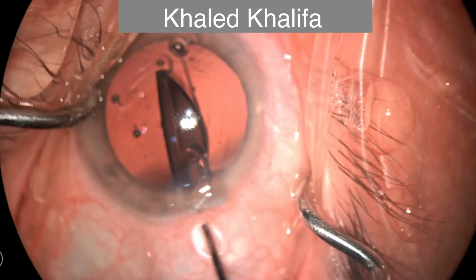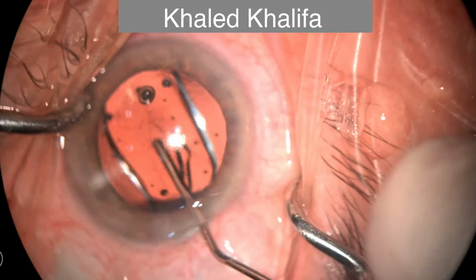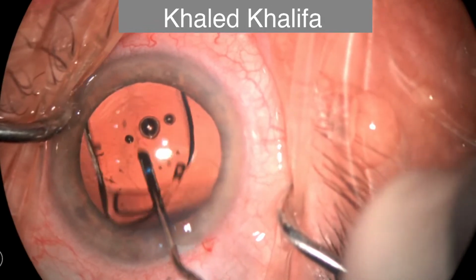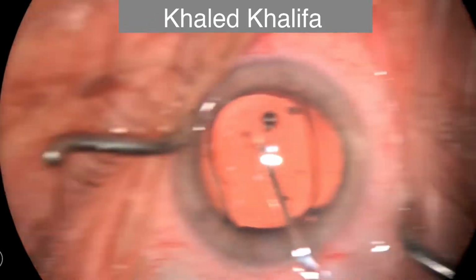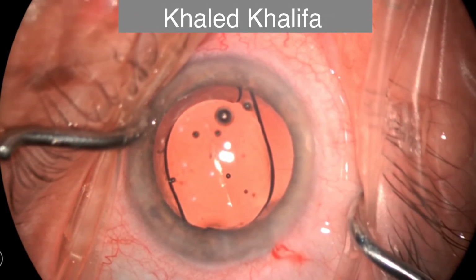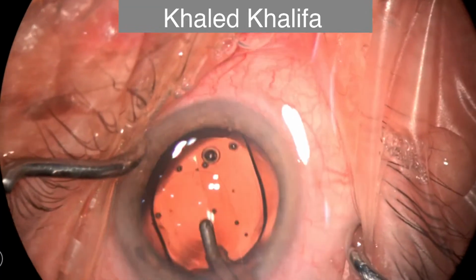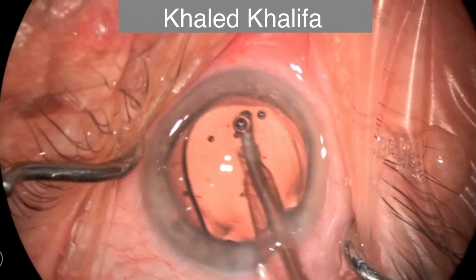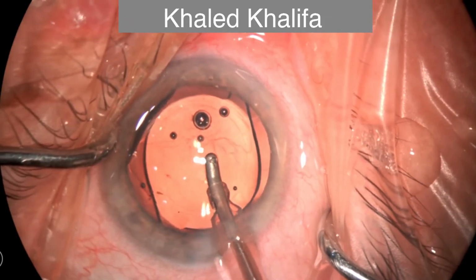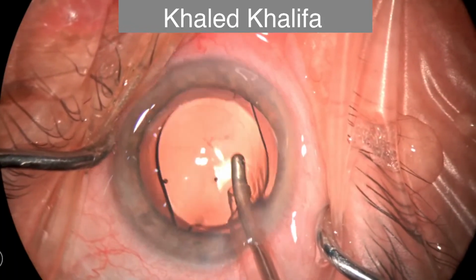Now reposition the IOL into the bag. Yes, and give it time to unfold inside the bag. Now the IOL is positioned inside the bag and this is perfectly unfolded. Then doing irrigation aspiration or visco removal from the anterior chamber and behind the IOL.